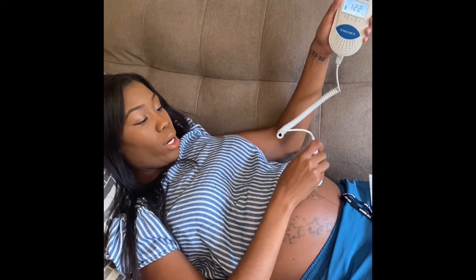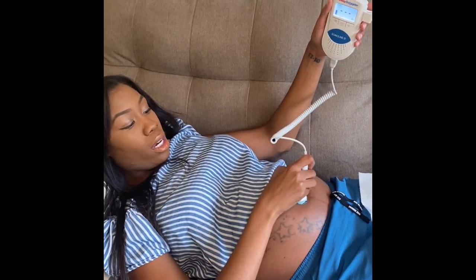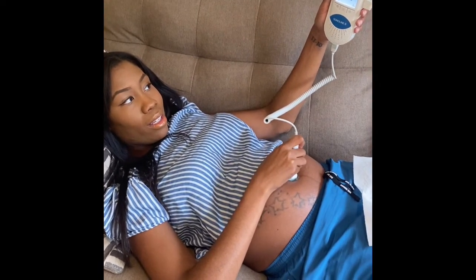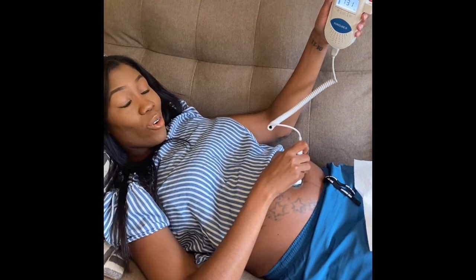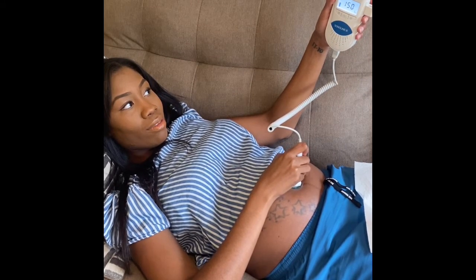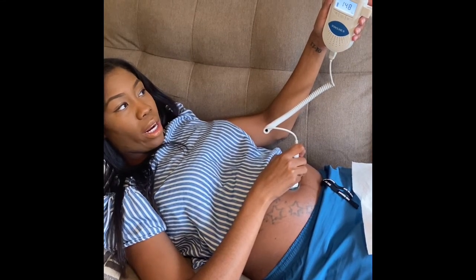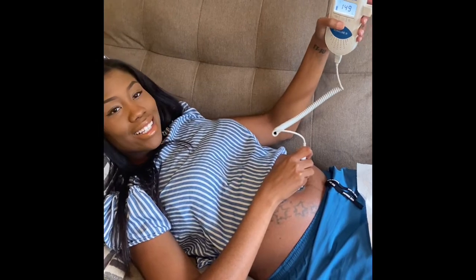But that's pretty much how it works. You can hear the heartbeat, and I could go back and forth to it. Sometimes it'll sound like horses galloping. That's what the doctor will tell you. I'm trying to get the... There you go. Sounds like horses galloping. Yeah, this is the perfect one. So 156, and it is going up and down just because I'm talking and moving as I'm doing this, and he's moving too, which makes it a little bit harder, but you get the gist. That's how you see it.